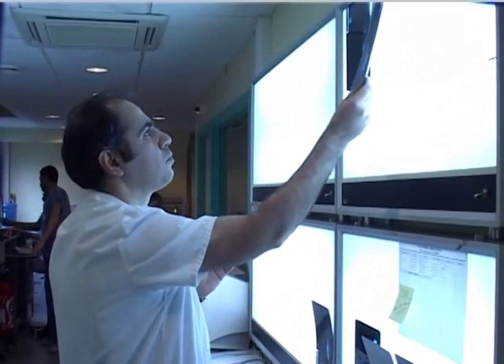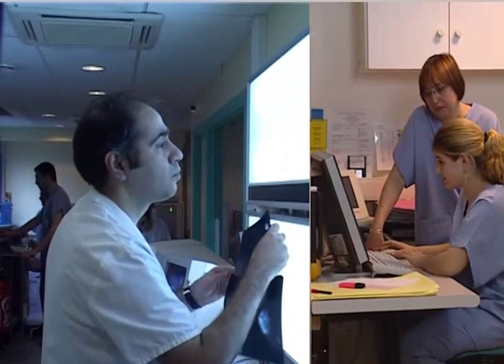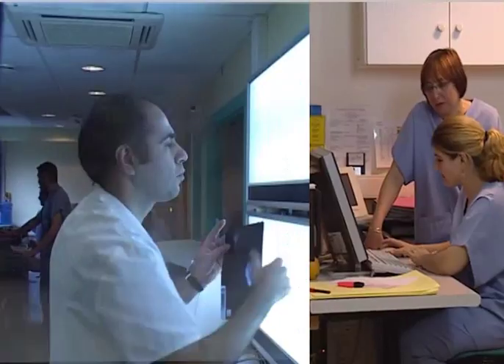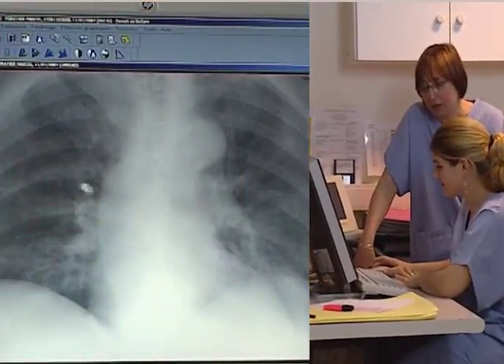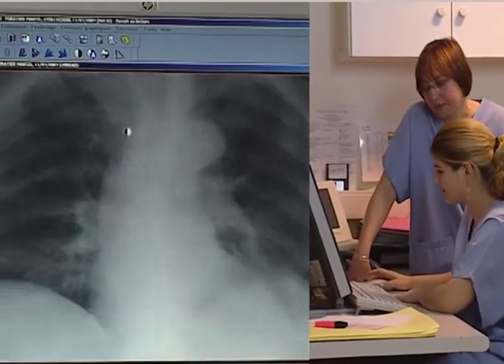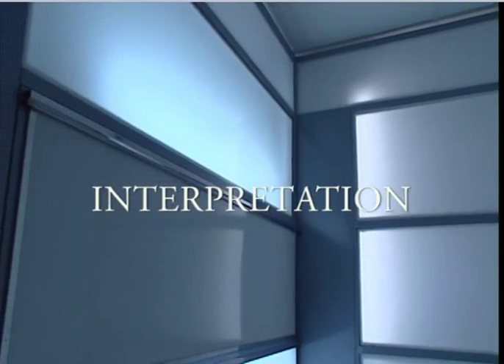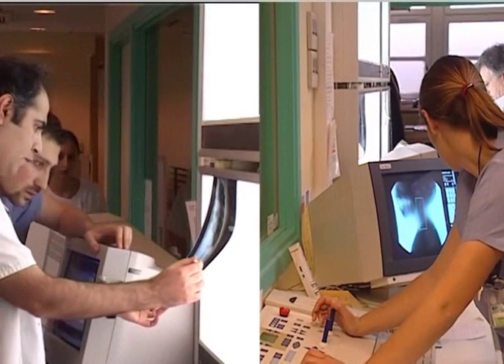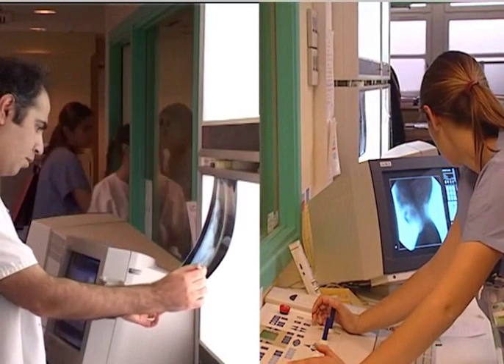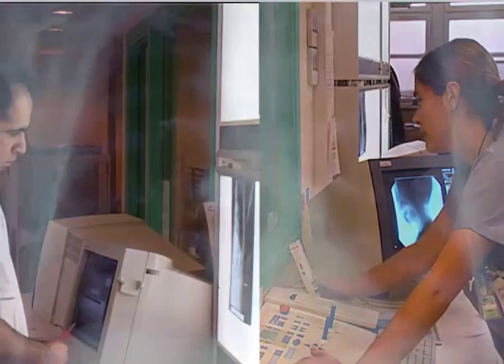But note that more and more, current technology tends to replace traditional radiosensitive film with digital recording plates. With the digital format, we can put together a bank of images that can be consulted or transmitted to a colleague. It also makes it possible to touch up the photo, to zoom in, or to emphasize contrasts, for example. The radiologist observes and interprets the photographs, either using a light box or on a control screen if digital images are involved. The information provided by the X-rays is purely morphological.